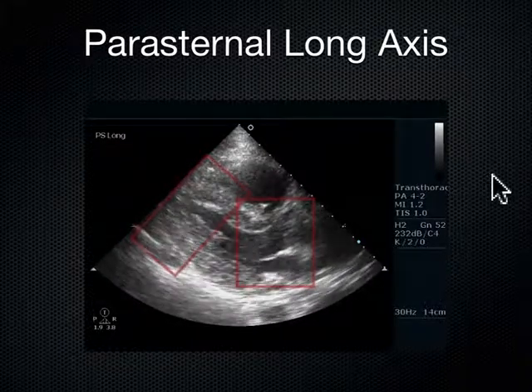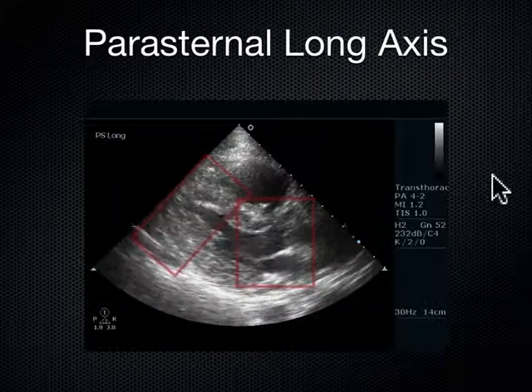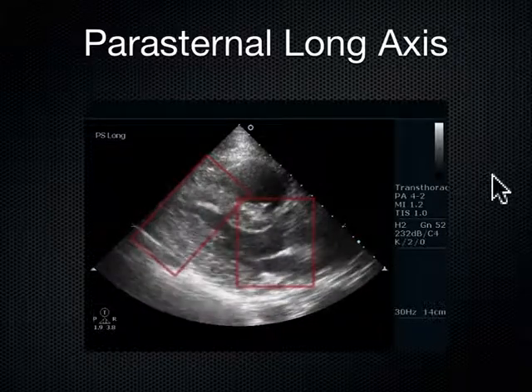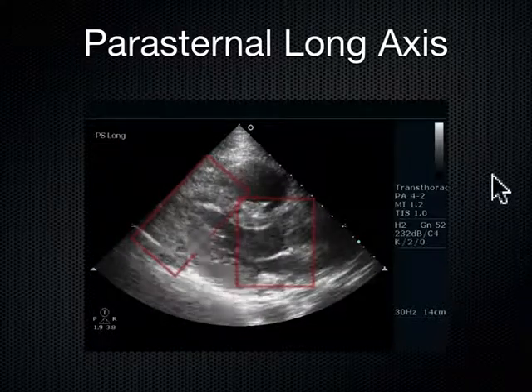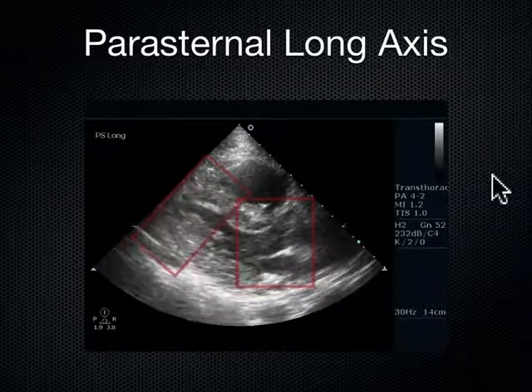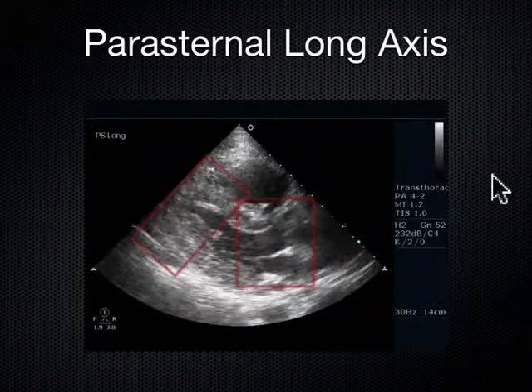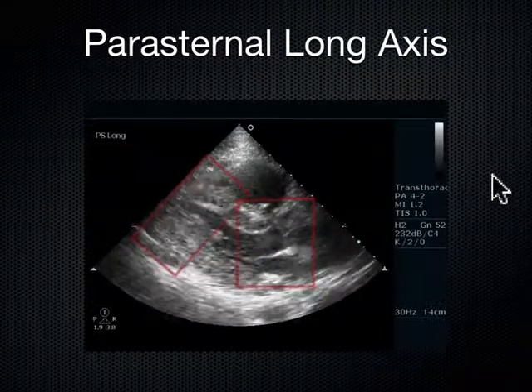When someone gets a right ventricle that gets as big or even bigger, like in this case, than the left ventricle, that's a sign of right ventricular strain. What would cause that? The right ventricle is trying to pump blood to what organ? The lungs, right? So the blood's trying to get out to the lungs. If the right ventricle is straining so hard to push that blood out to the lungs because something in the lungs is not letting it get there, like a blood clot, pulmonary embolism, the right ventricle just starts to get bigger and bigger. We call that RV strain.